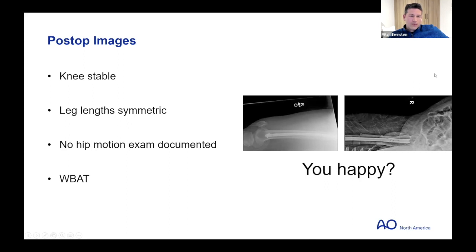And if you're doing an open reduction, your brain potentially won't let you think that there could be an issue. I think having the butterfly fragment did potentially make it a little bit more challenging from an open reduction standpoint. But I think they manipulated the bone fragments to be able to get the guide rod across. It wasn't clamping it or anything like that.